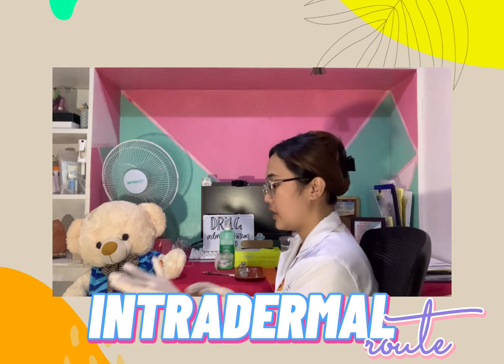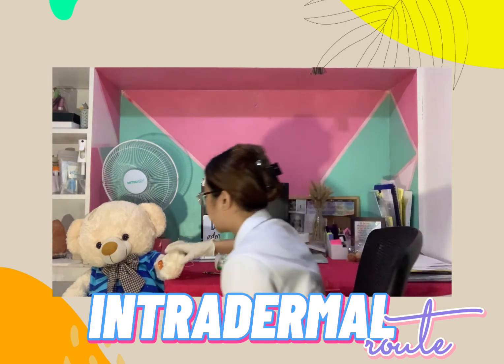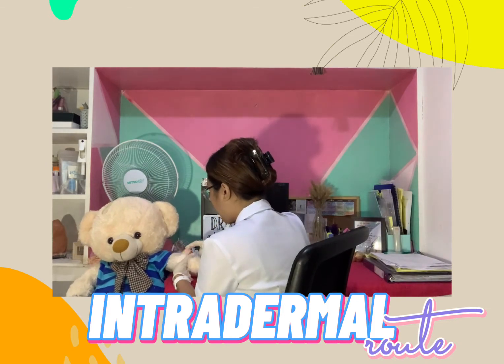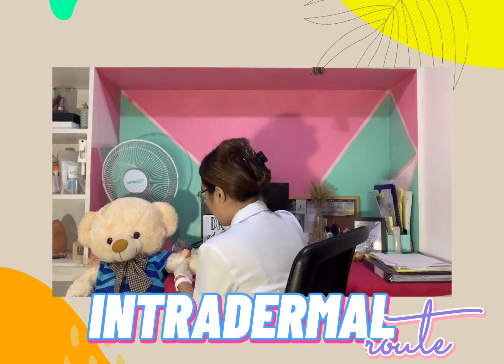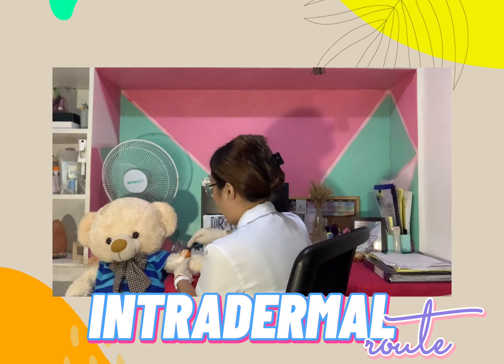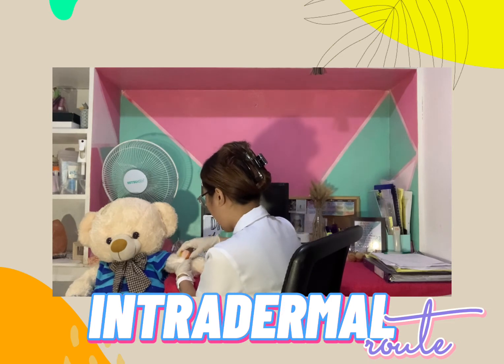Then, after that, we need to assess the area of the patient on the inside forearm of our patient, where hair is less visible and where we can perform the skin test. So we will assess the area.